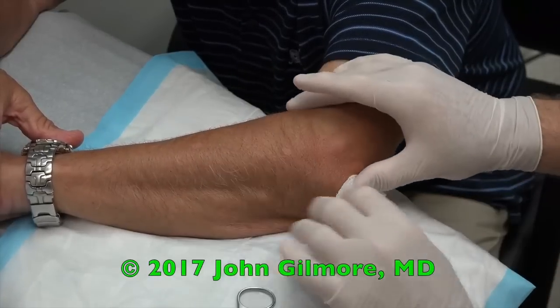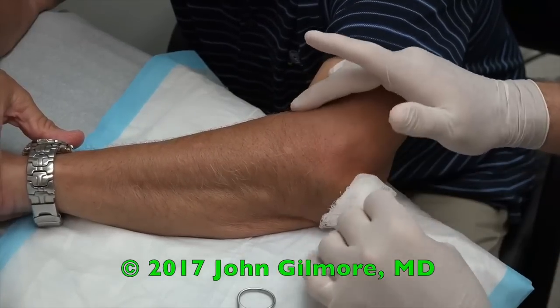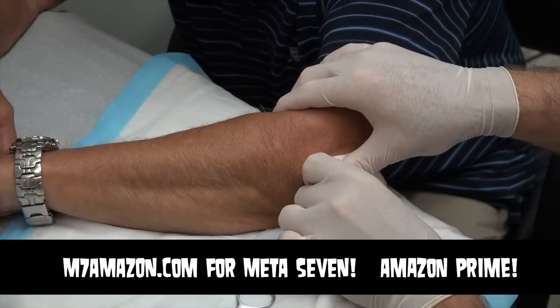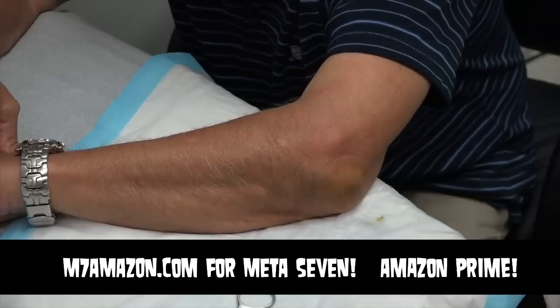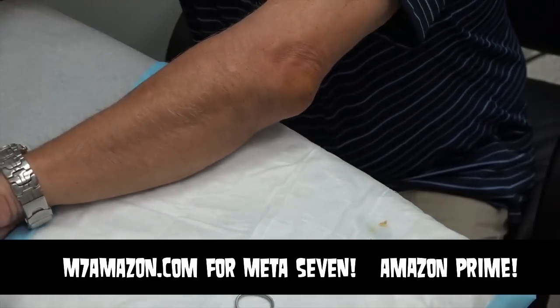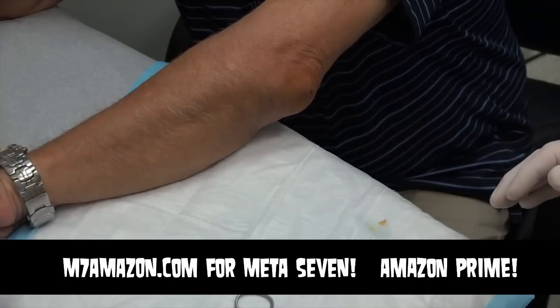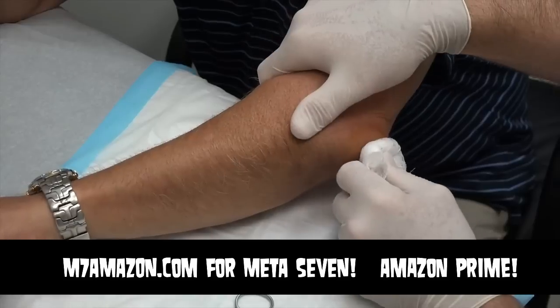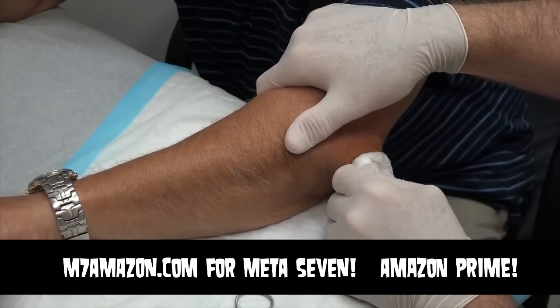Did that hurt much? No. I'm surprised — the whole day, I didn't even know I had that yesterday. We're going to put a bandage on that and do a little compression wrap. Just take it easy with this elbow today. Tomorrow you can pretty much be back to normal again. Do you have any questions for me, Mr. Medic?